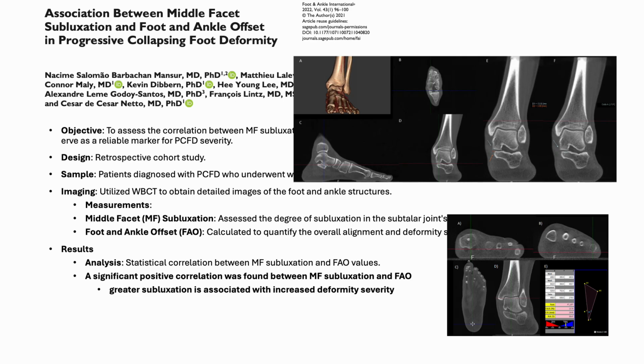If you're subluxating at a joint, that likely means it's a worse deformity, whether it's at the first MPJ, whether it's at the talonavicular joint, whether it's at the middle facet. And that's where it really makes sense. But are you going to spend a bunch of time doing all these measurements? Probably not a huge amount, but you can help pre-op versus post-op really dive into it if you got good deformity correction. I fuse a lot of subtalar joints for flatfoot, so I don't secondarily go back and look at it.